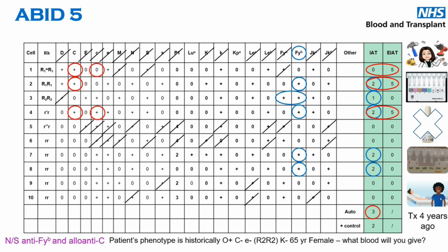And then just for completeness, I've excluded anti-D. Patient's auto is positive. So remember what I was saying before, it's really important. If the patient's auto is positive, we'll have to do a DAT. So that's part of the tools that we're using. You also want to think about doing a phenotype on your patient, but again, this is going to depend on the history. So we could use anti-Duffy B to determine if there's a Duffy B, and we need to find out if it's big C antigen negative or positive. But we need to do a DAT.